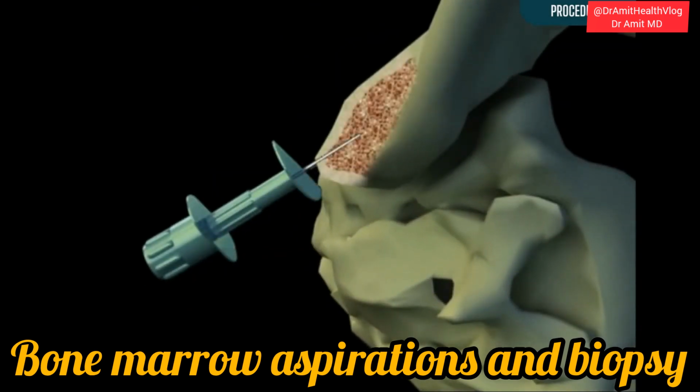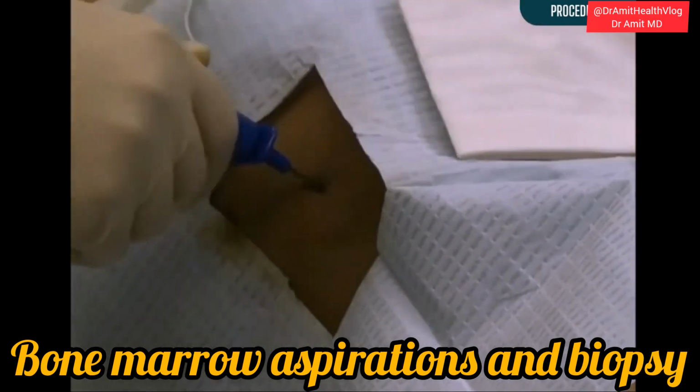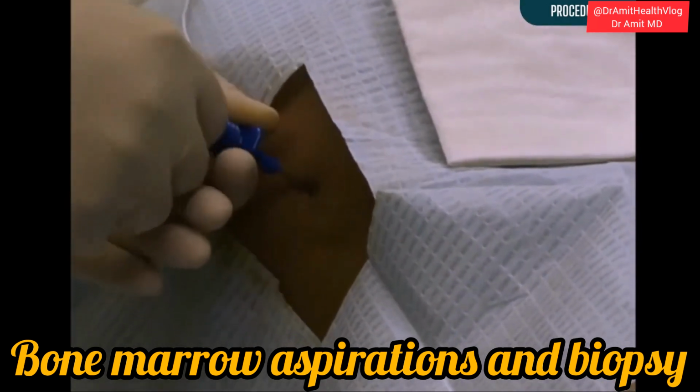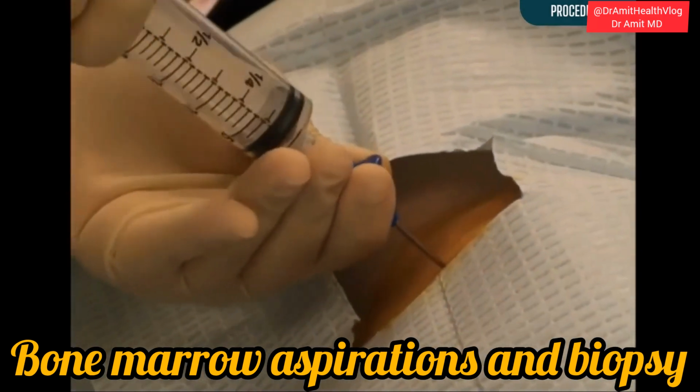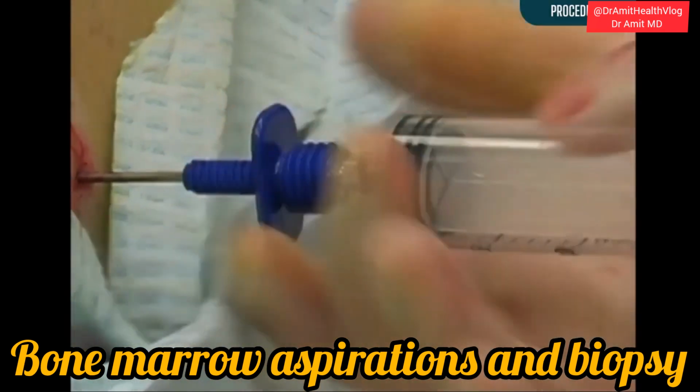However, the angle of entry is important. In general, the needle should be advanced at an angle completely perpendicular to the bony prominence of the iliac crest. Once the needle is through cortex and the marrow cavity is entered, the needle should stay in place without being held. Next, remove the stylet. Attach a 30-milliliter syringe without heparin and aspirate 1 milliliter of marrow with a firm pull.